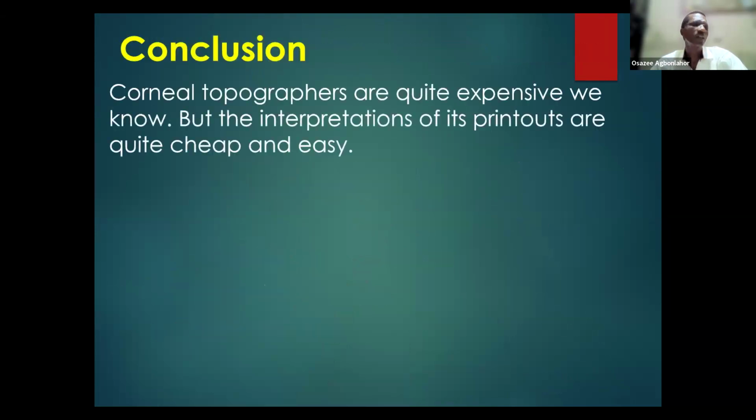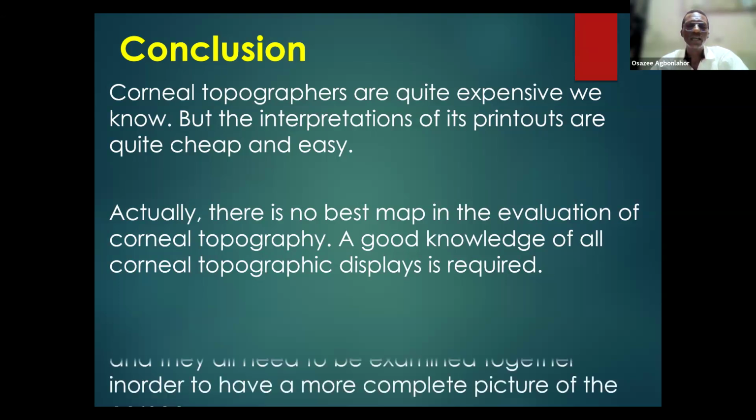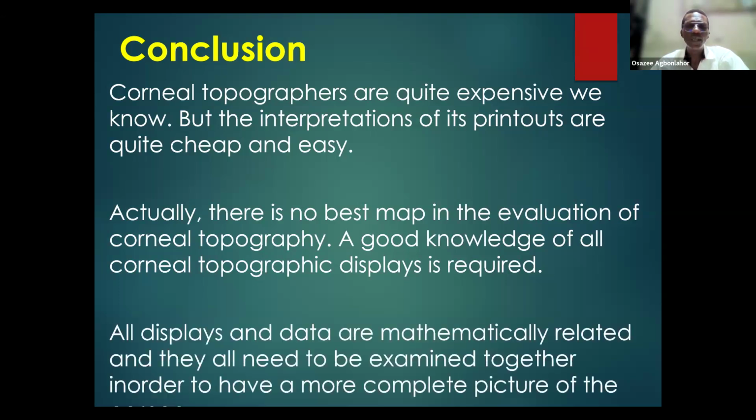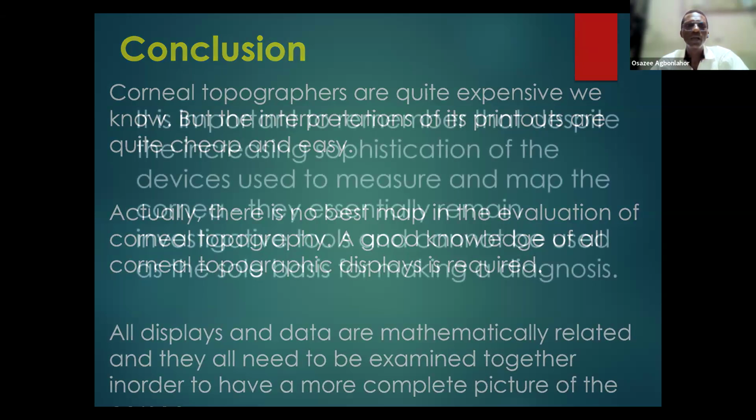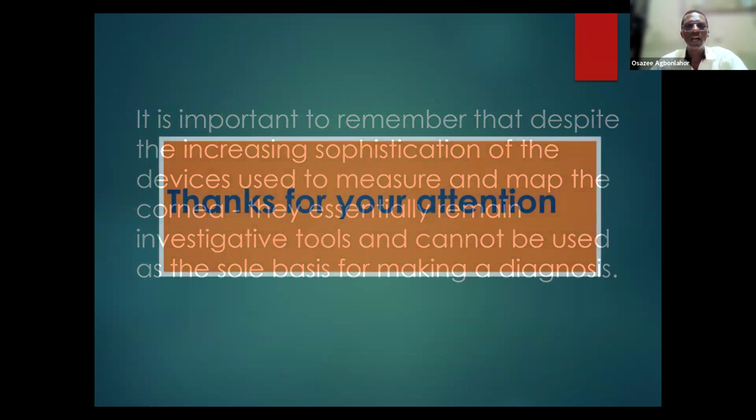In conclusion, corneal topographers are quite expensive, and we know that. However, the printouts are cheap. Patients can send you their printout that they did in Canada or in the UK, and they ask that you interpret it for them. I think that should be enough. The information that we're having tonight should be good enough to explain what that printout is talking about. And so let us take time to know this to help our patients better. So thank you for your attention.